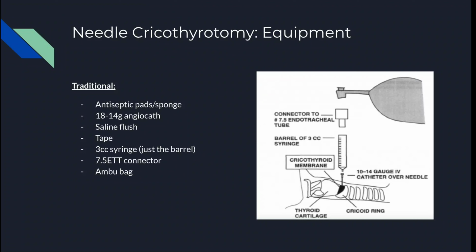Tape, obviously, this is more or less for securement. And we really can get creative with this. However you accomplish it, it doesn't really matter if you chevron the tape, but just some way to secure this airway. Because remember that at this point in time, this truly is literally this patient's lifeline. So it needs to be secured in at least a somewhat good fashion.